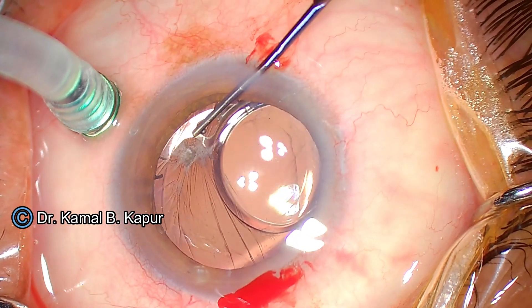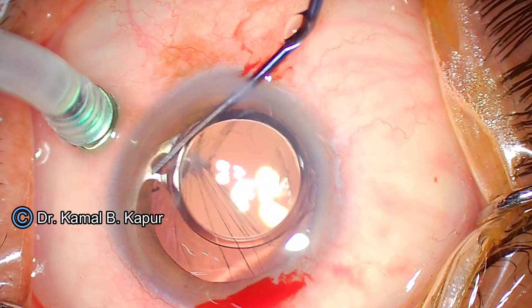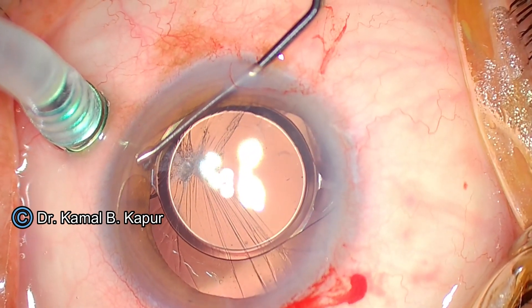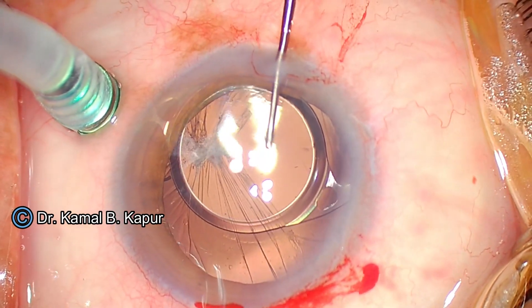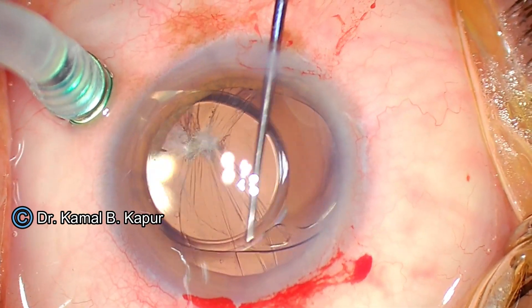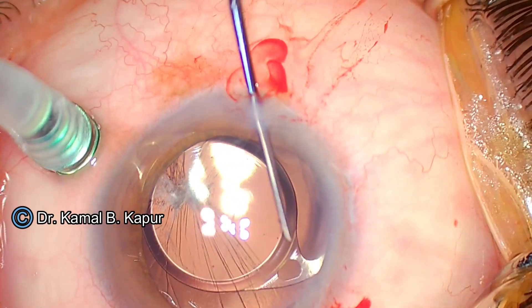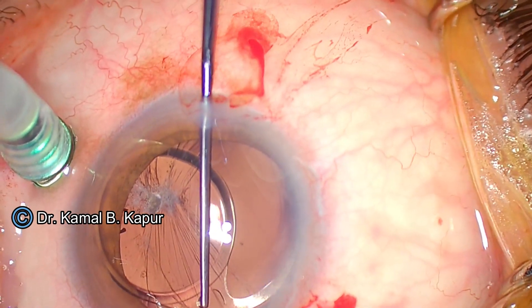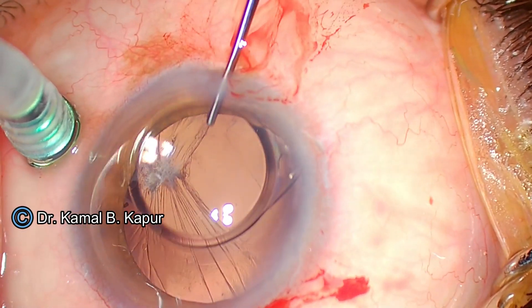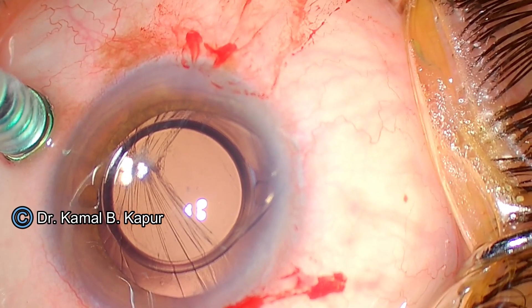I'm nudging the lens out of the capsular axis. Luckily, the surgery was done around seven to eight months ago. Now I nudge the IOL out of the bag and rotate it anti-clockwise to get it out of the bag. The aim is to get both haptics out and land them onto the iris to facilitate the cutting procedure. I've nudged both haptics out of the bag superiorly and into the anterior chamber onto the iris. We must be very careful not to damage the endothelium during these maneuvers. It's a very good idea to keep coating the endothelium with a good viscoelastic.